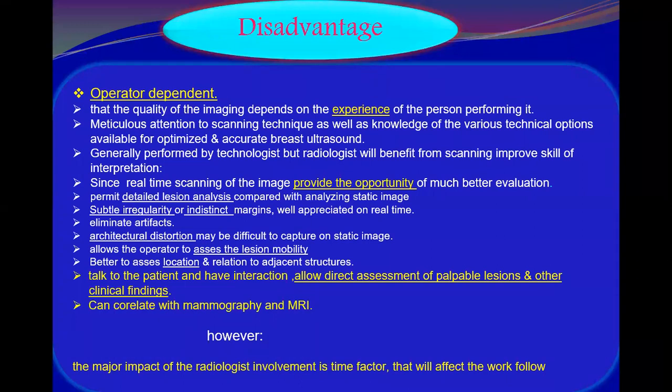And as we mentioned, it is interactive, you can talk to the patients. You make sure, is it tender, not tender, that you are talking about the same lesion. This is the clinical concern or the patient concern. It is the same as the lesion on mammography and the lesion you have seen. You are talking about all these things.